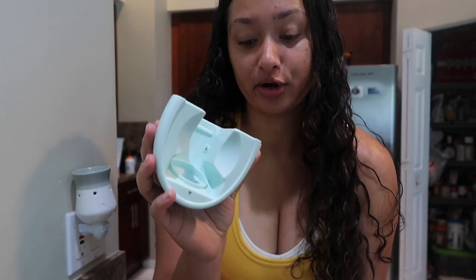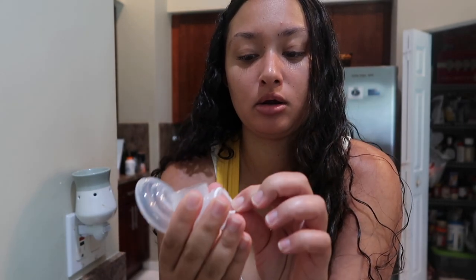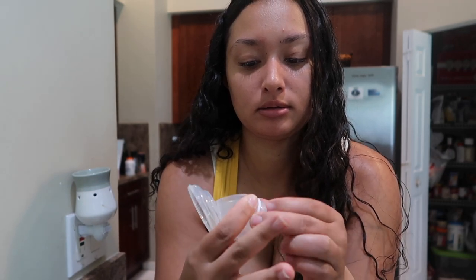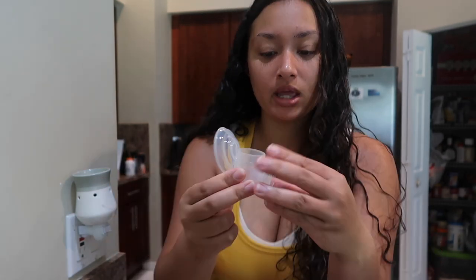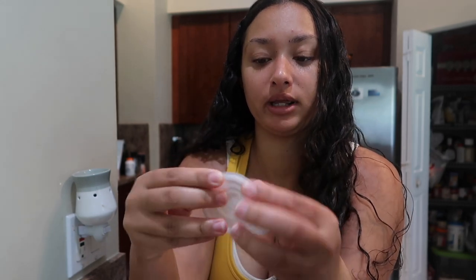So now all of the pump parts are done drying. It is really important to make sure that all the parts are completely dry before you put it back together again. So I'm just gonna go ahead and show you how easy it is to put it together. So first, I'm just gonna take this little silicone loop and put it right around here. It will just go right in like that. Next, I'm gonna put this piece and line it up right here and just fold it in.